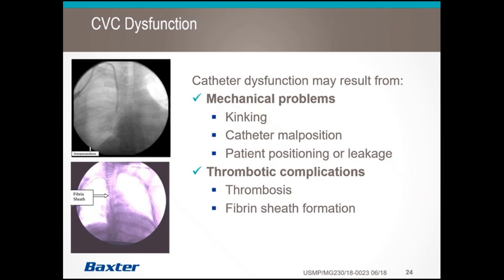One caveat or exception to this is when you are aspirating a hemodialysis catheter or a VAS cath for patency. In many cases with central lines, the general rule of thumb is to flush the catheter and then aspirate for patency. This is not recommended with a VAS cath or hemodialysis catheter because they are often packed or locked with an anticoagulant such as heparin or citrate to maintain the patency of that catheter. If you were to flush a hemodialysis catheter before assessing it for patency or before aspirating, then you would inadvertently, in many cases, give your patient a bolus of heparin or citrate or whatever that catheter happens to be packed with.